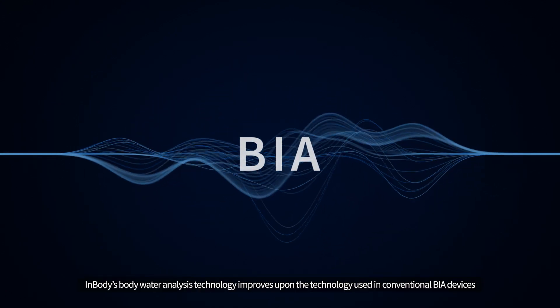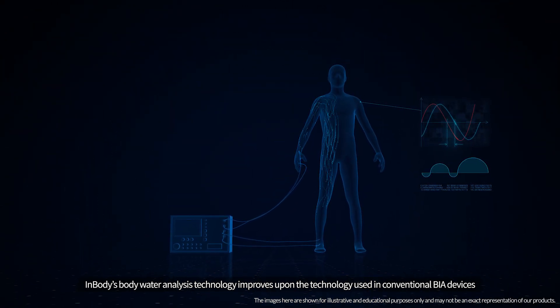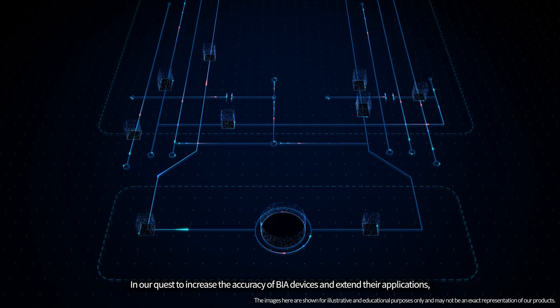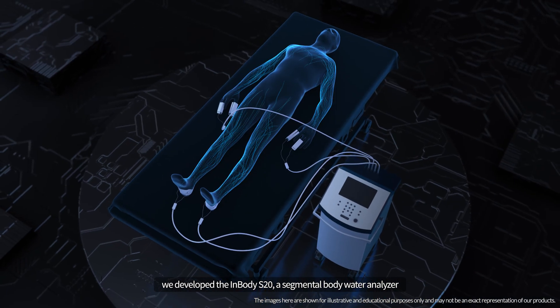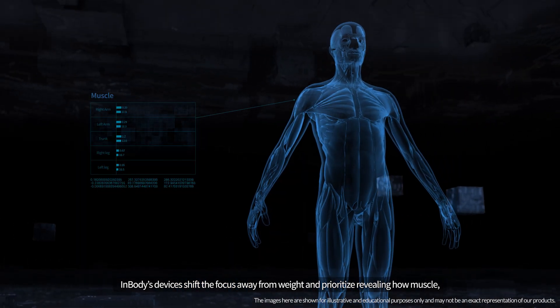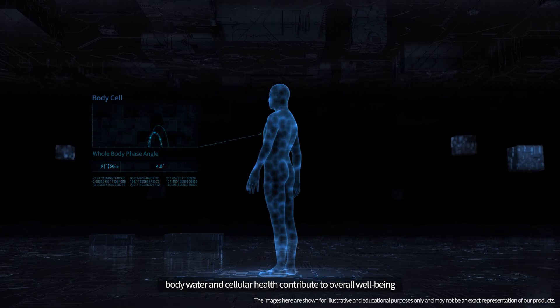InBody's body water analysis technology improves upon the technology used in conventional BIA devices. In our quest to increase the accuracy of BIA devices and extend their applications, we developed the InBody S20, a segmental body water analyzer. InBody's devices shift the focus away from weight and prioritize revealing how muscle, body water, and cellular health contribute to overall well-being.